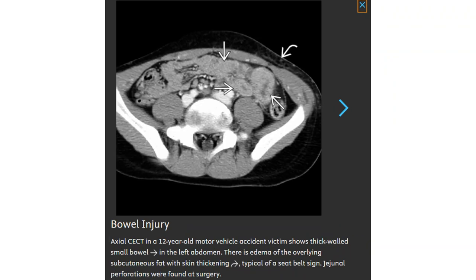Contrast-enhanced CT in a 12-year-old motor vehicle accident victim showing a lacerated small bowel loop in the left abdomen. There is edema of the overlying subcutaneous soft tissue with skin thickening, typical of a seat belt sign. A bowel perforation was found at surgery.